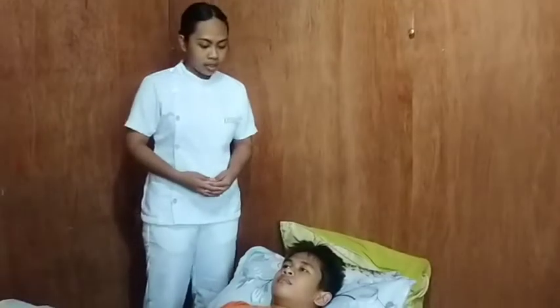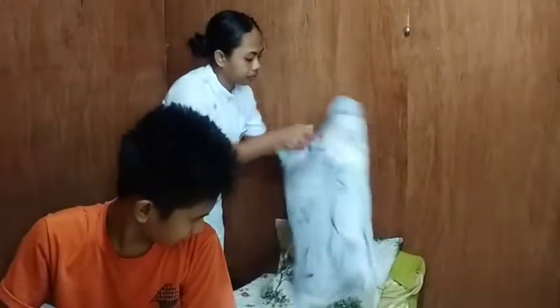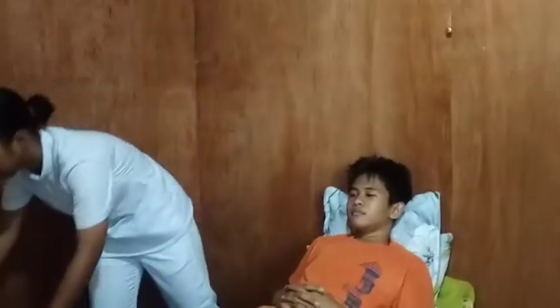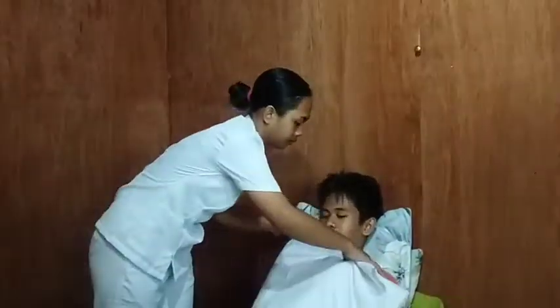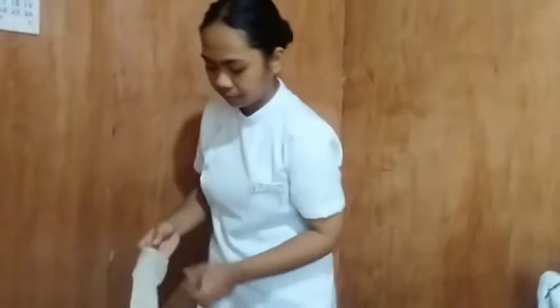Provide well-lighted room. Provide privacy by screening and closing windows and doors. Assist the client to a high Fowler's position if his or her health condition permits, and support the head on a pillow. Place a towel or disposable pad across the chest. Apply clean gloves.